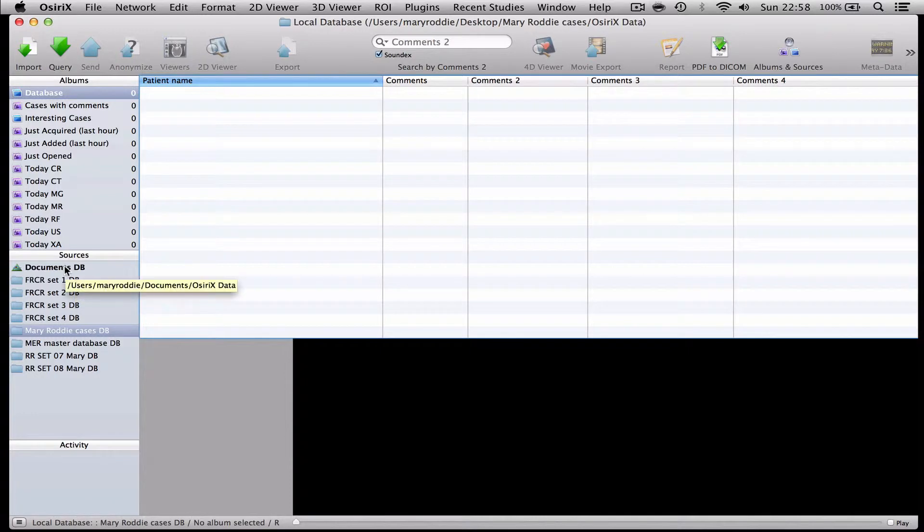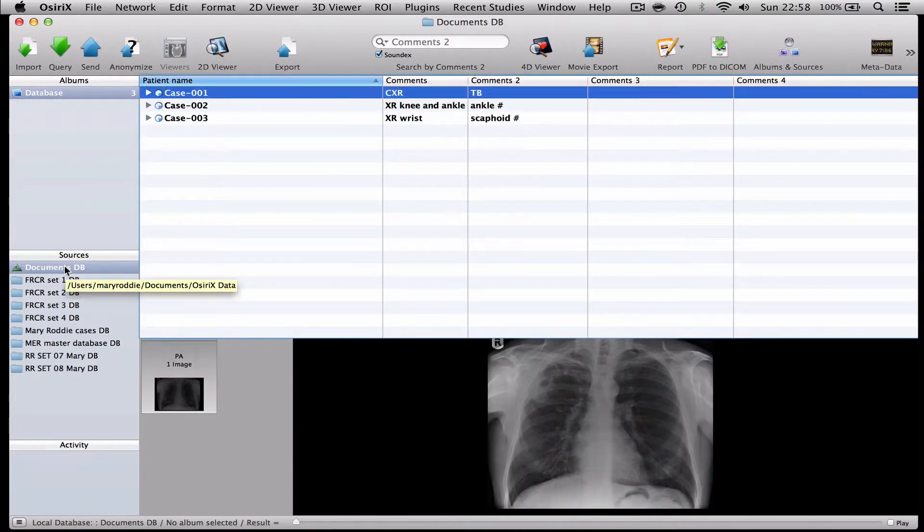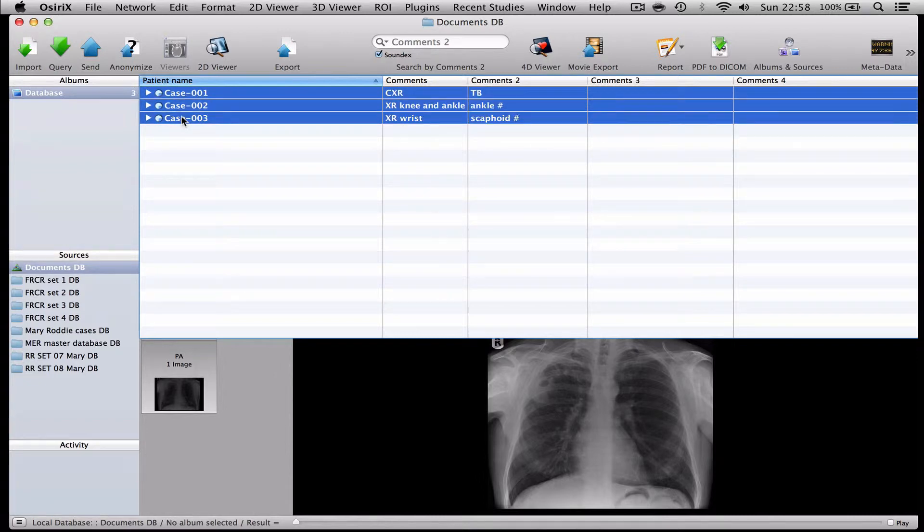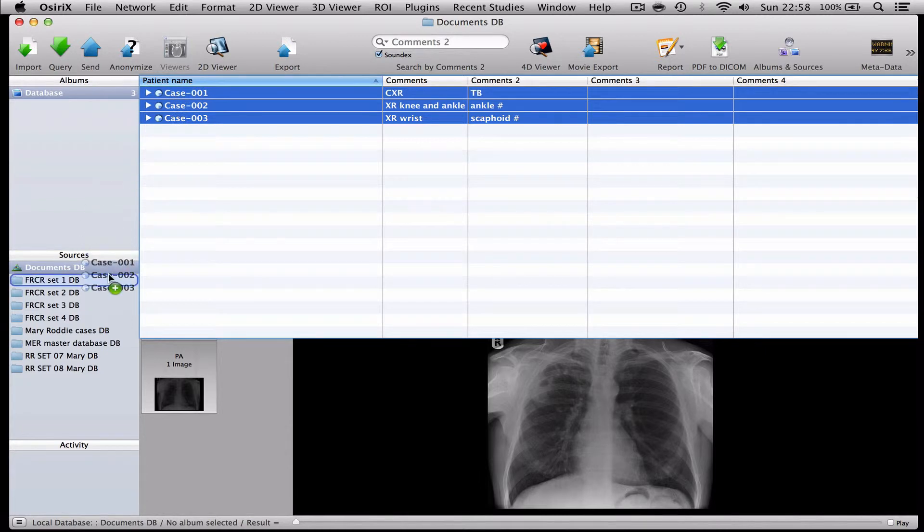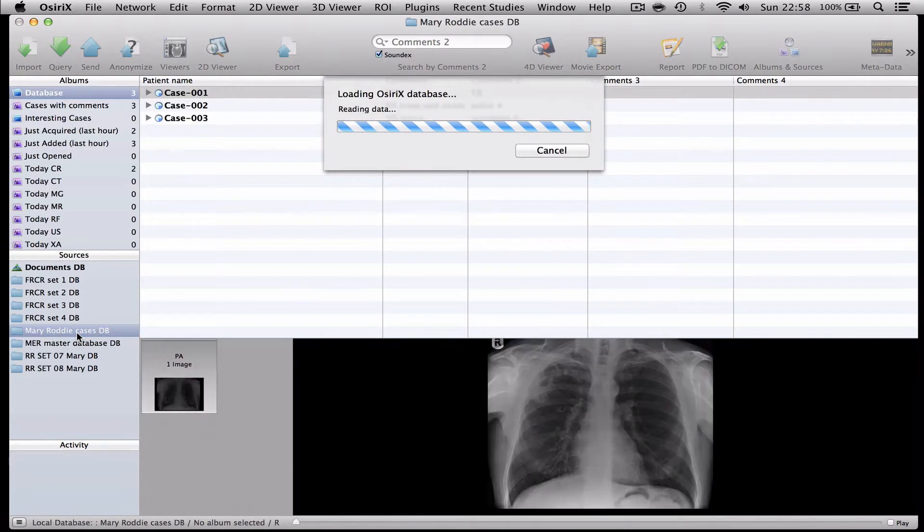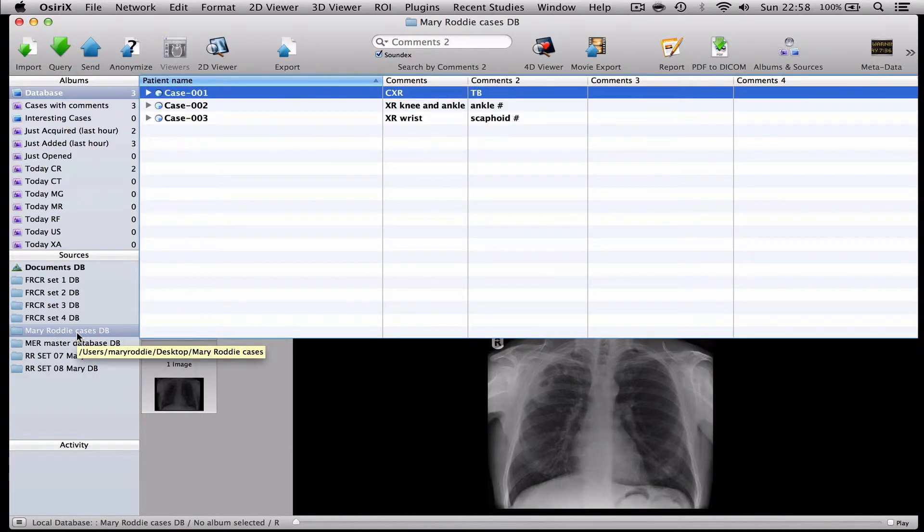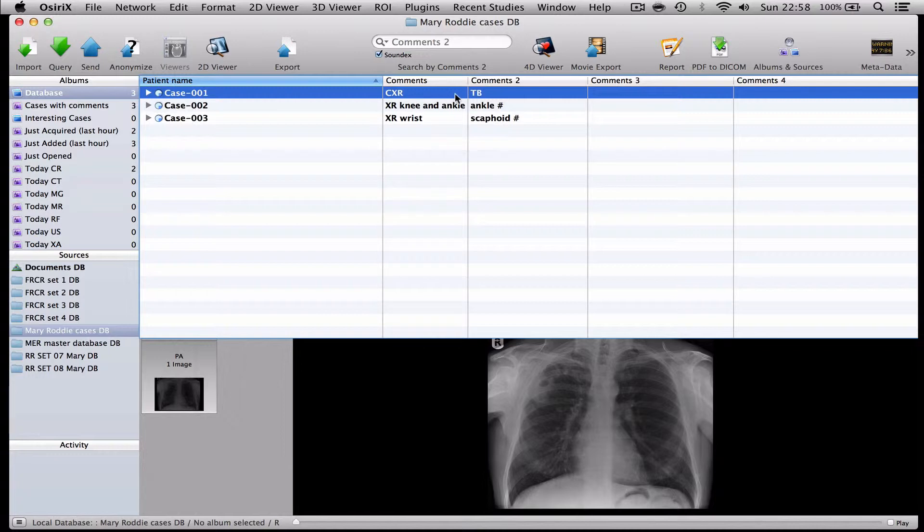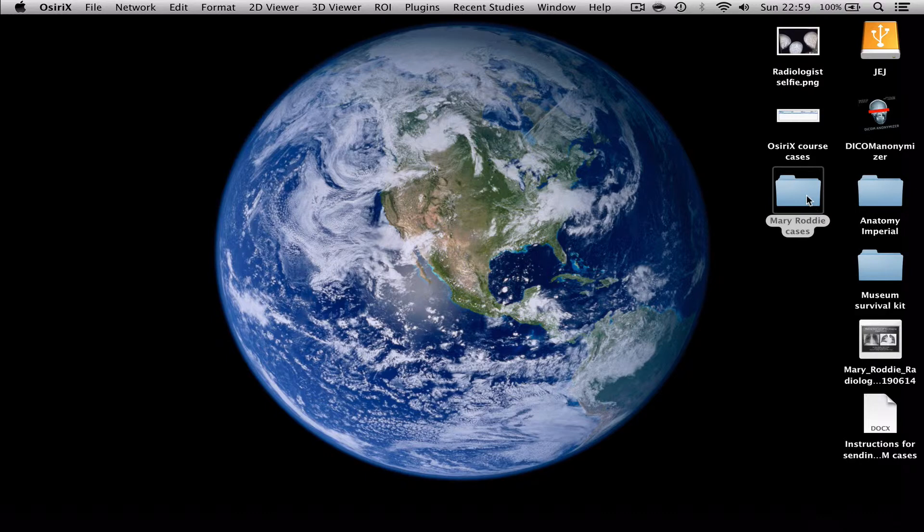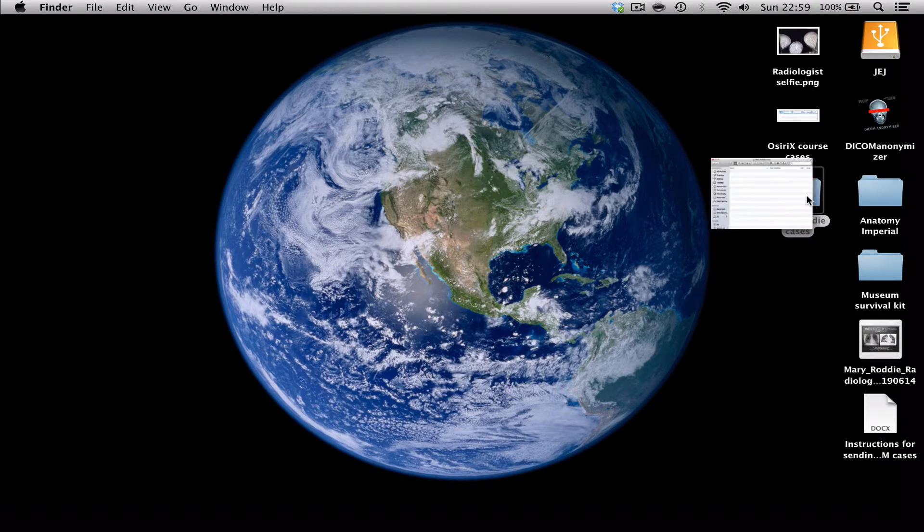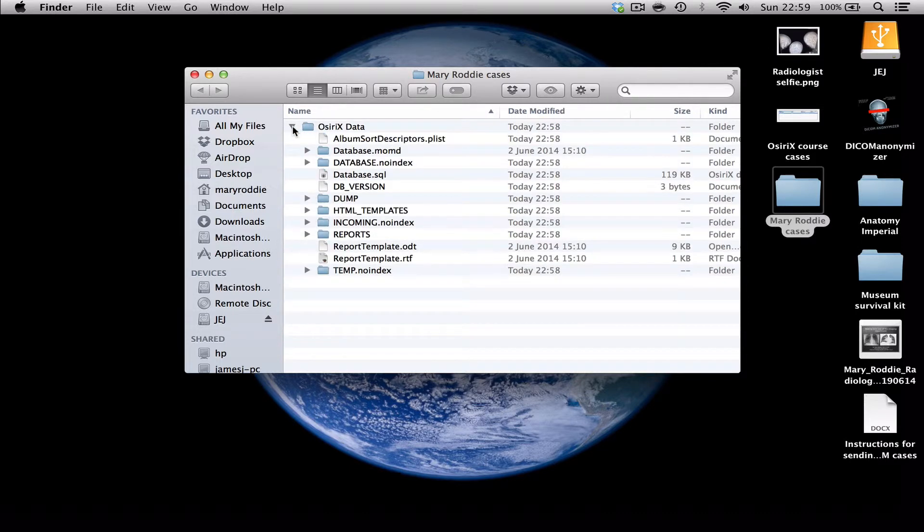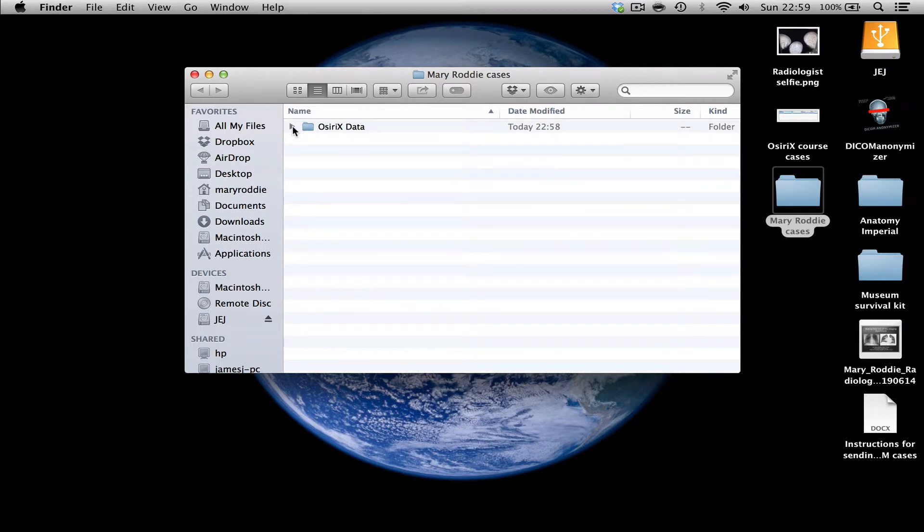So if I go back to the default database where I've created these anonymised cases and highlight all three cases, I can simply copy those across into the folder. And if you look at Mary Roddy Cases now you will see there are three anonymised cases that are annotated, ready for my colleague to use in their meeting. Now if I look at the case on my desktop you will see that now it has something inside it called Osirix data. If I look inside that I'm not going to see case 1, case 2 and case 3 because you don't see that. But believe me those cases are in there.